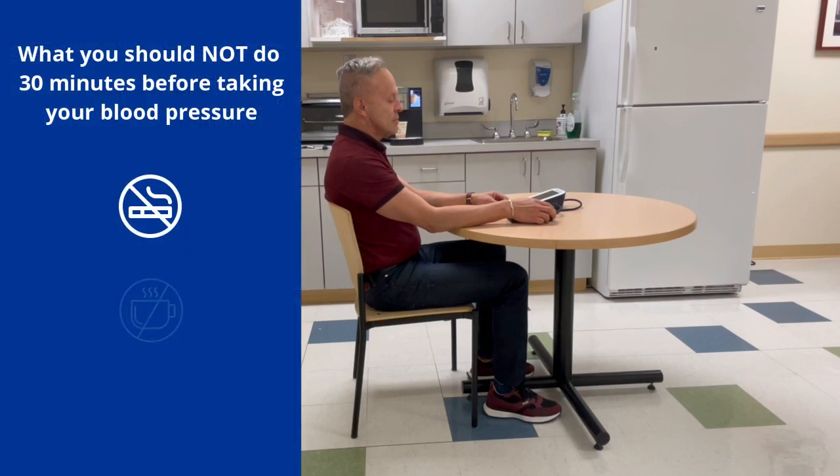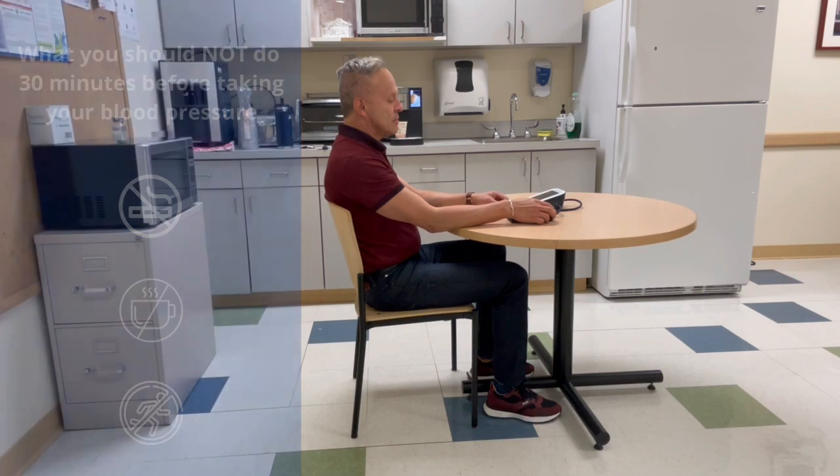You should not smoke, drink caffeinated beverages, or exercise 30 minutes prior to checking your blood pressure.